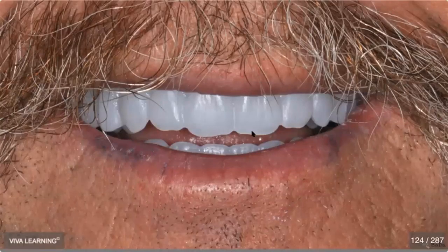And then what you can do also is take a disc and individualize these teeth to make them look much more vital and natural. And you tell them only that the shade is going to be a little bit different.